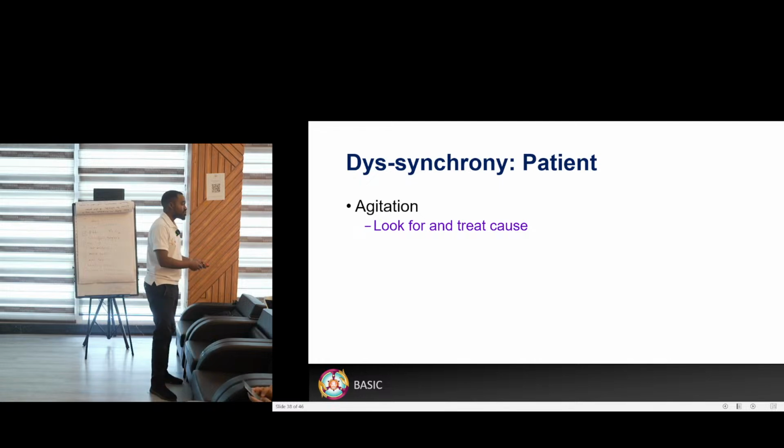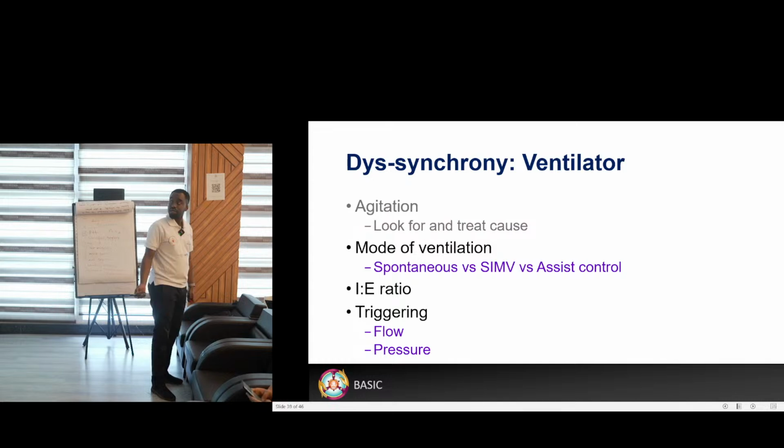But also, when you put the patient on pressure support mode and the lungs are still worse, you still need some time to let them heal. So you can add a sedation component. Sedate your patient, make your patient comfortable, then you can put on your synchronized mode. So the mode of ventilation could be an issue. Try and look for the best mode for your patient.